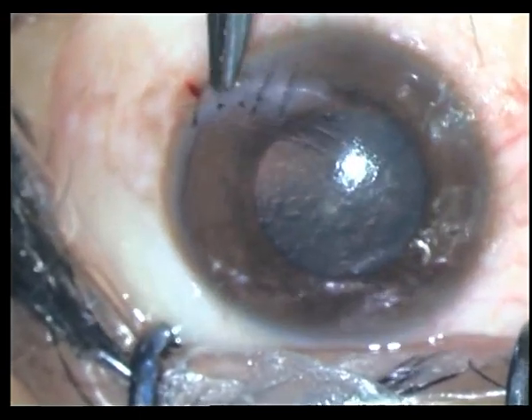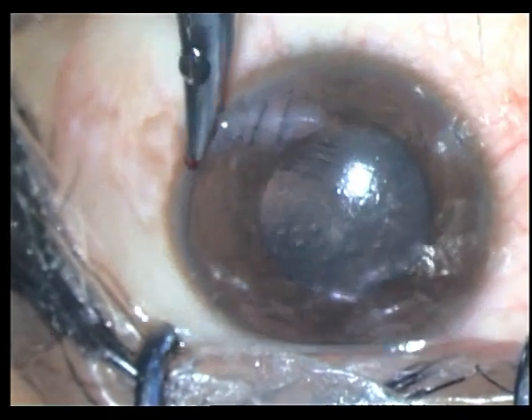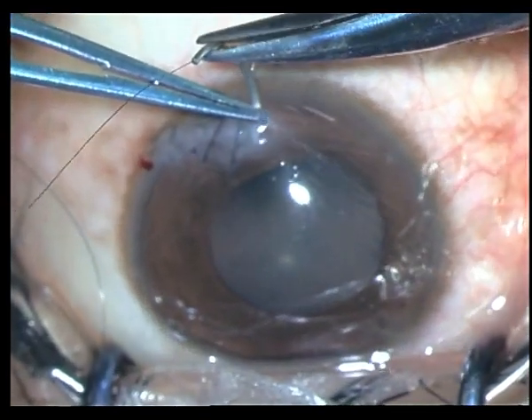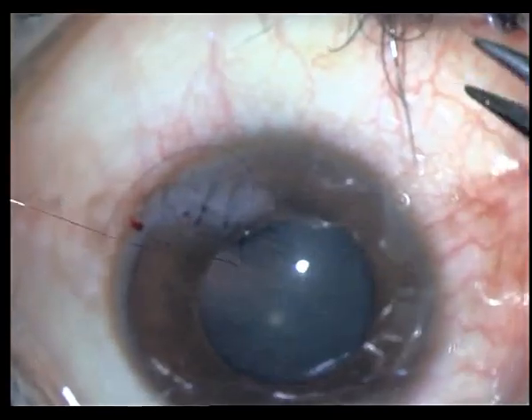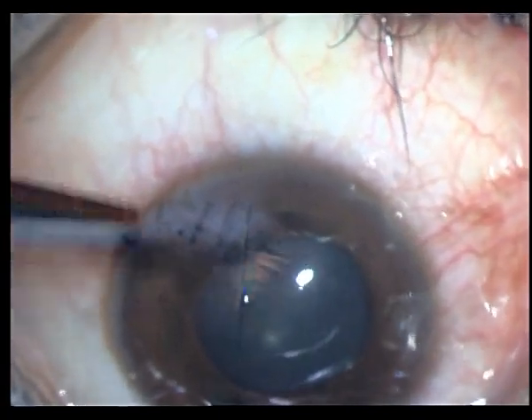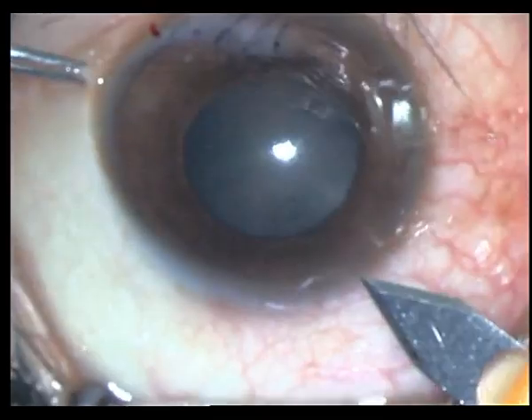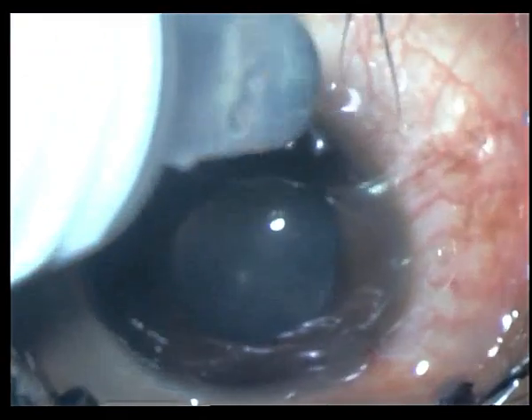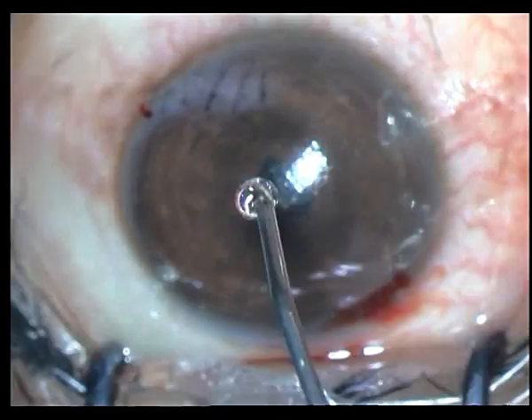Always bury your knots. If the AC keeps shallowing, it's a good idea to fill it in with BSS or with air and then suture. However, I didn't have a problem with this one so I just went ahead and sutured. Now I went in with my 2.8 millimeter keratome — as I told you earlier, I have to take out the hair follicle.